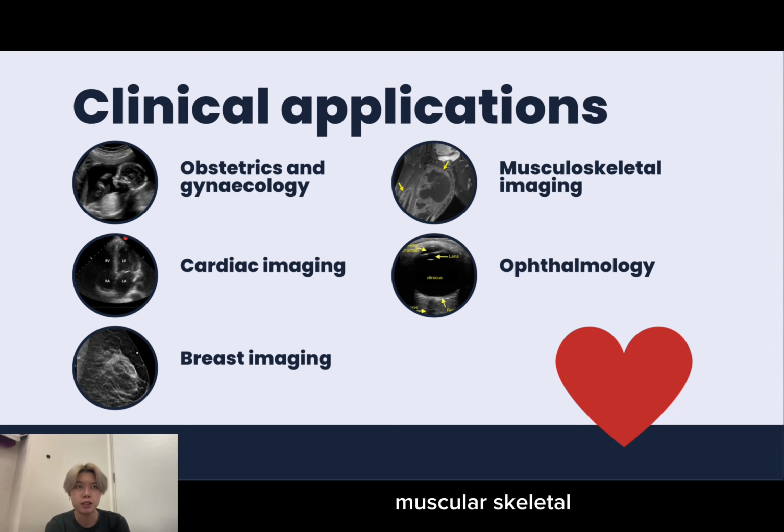During an ultrasound examination, doctors can view the internal body's joints, muscles, and blood arteries. Investigating muscular pulls, tears, nerve issues, and conditions like osteoporosis and arthritis is made easier by these images. Soft tissue injuries, collagen disorders, and other soft tissue conditions are all treated using ultrasound.